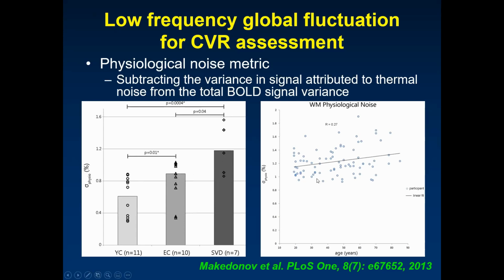groups. And shown on the right side is this scatter plot of the white matter physiological noise as a function of age, and there is also a significant age effect in this parameter.